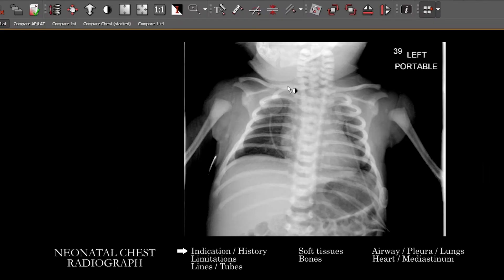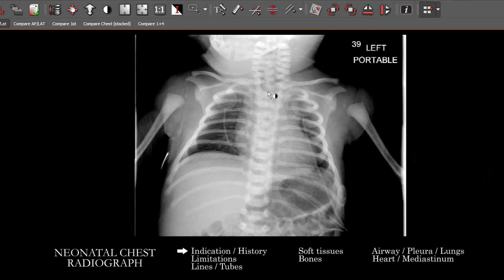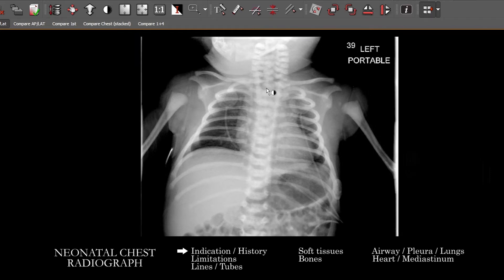Let's take a look at this neonatal chest radiograph. A lot of these, because the patients can be so small, is that you'll get quite a bit of the upper abdomen as well. Context plays a large role here. You want to know the gestational age of the patient, the day of life, whether it was a vaginal versus C-section delivery. These sorts of things really impact your interpretation, as do any underlying medical conditions for the neonate or the mother, and treatment such as intubation or ventilation.